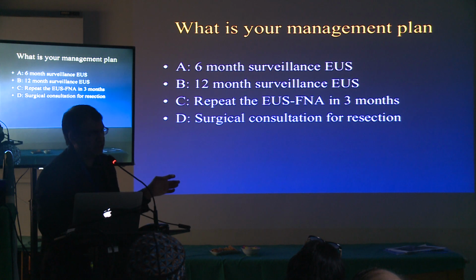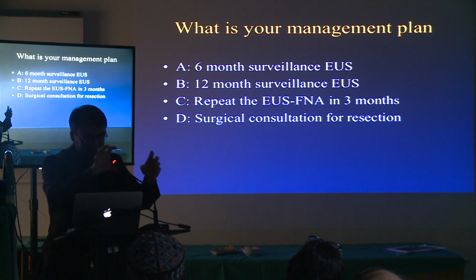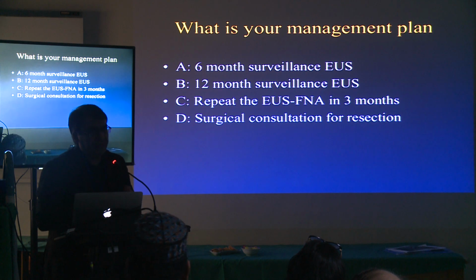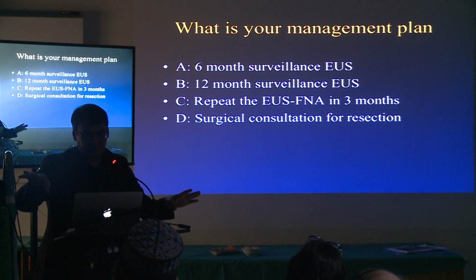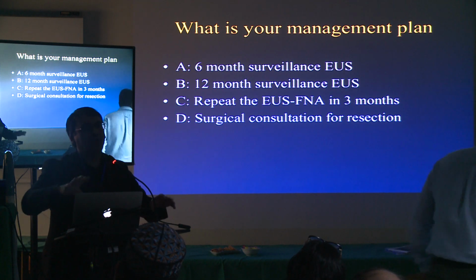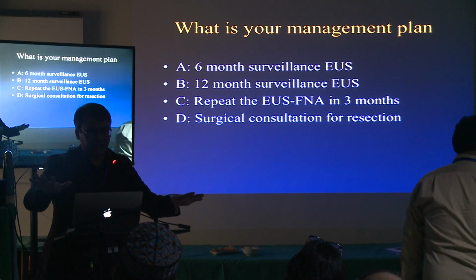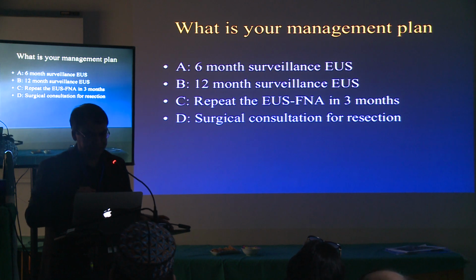So in this patient, even though it was a little bit focal area, what would be your management if, let's suppose, FNA shows no cancer cells, okay? It's not totally benign, but there is no cancer, not even a high-grade dysplasia, okay? So that's the FNA. What would you do with this patient?